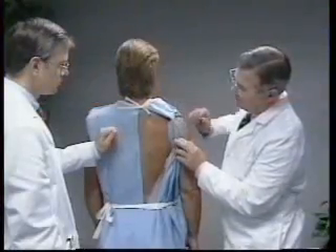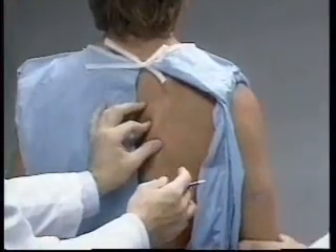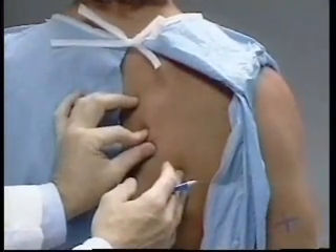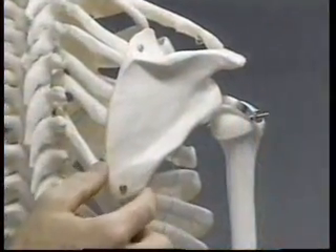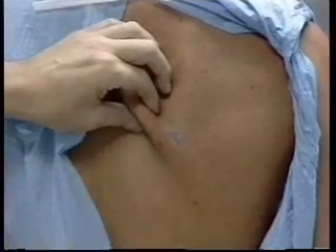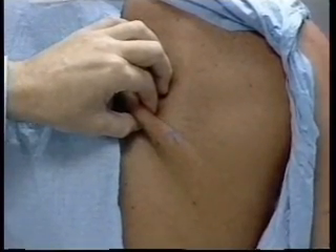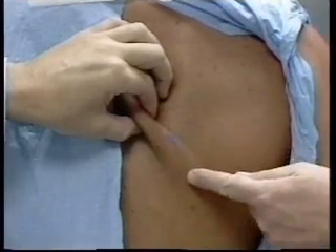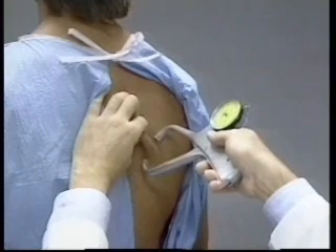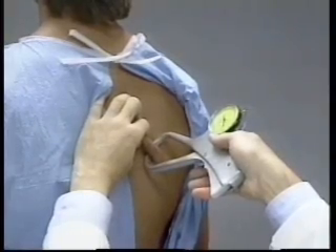The subscapular skin fold is measured with the subject standing upright, shoulders relaxed, and arms hanging loosely at the sides. The technician stands behind and gently palpates the inferior angle of the right scapula, which is the lowermost tip of the triangular bone, and a mark is made there. The technician gently lifts a fold of skin and subcutaneous adipose tissue with the index finger directly above and medial to the mark at the inferior angle of the scapula, with the thumb reaching toward the spine. The skin fold forms a line extending diagonally toward the right elbow. The jaws of the caliper are placed perpendicular to the length of the fold, two centimeters from the fingertips, with the tip of the top caliper jaw directly on the mark at the inferior angle of the scapula.